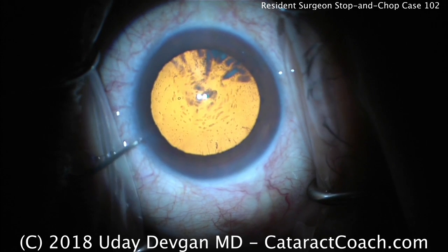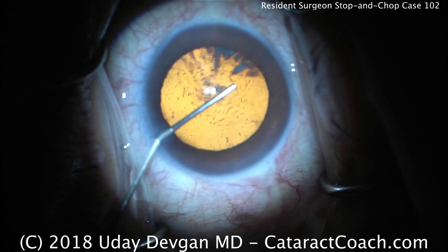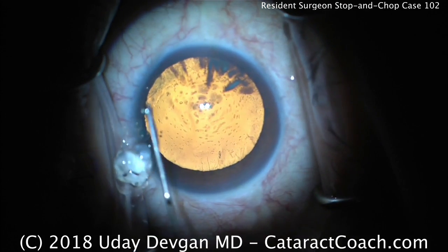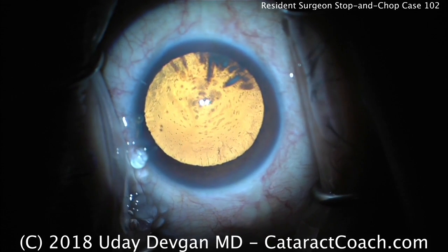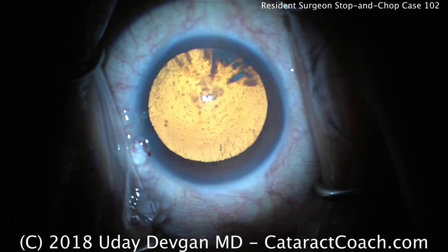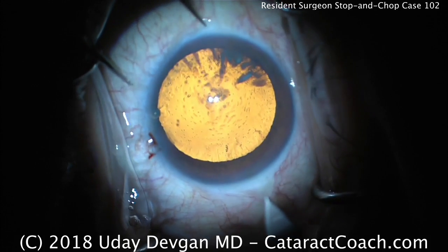The resident is now going to fill the anterior chamber with viscoelastic — it looks like a cohesive viscoelastic. That's a nice strong fill; you can see the viscoelastic coming out of the eye, which is definitely typical for a cohesive. The plus side is better chamber maintenance and an easier capsulorhexis, but the downside is it will be washed out more easily and won't protect the corneal endothelium as well during the phaco portion.